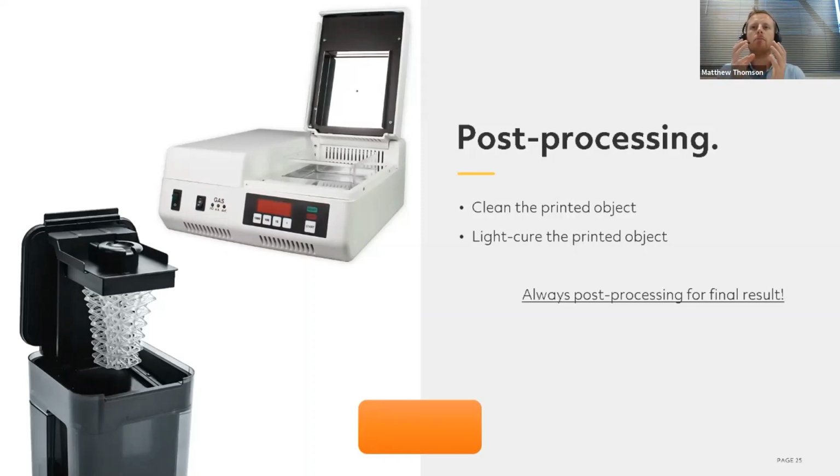Then there's the post-processing. So many of you will have used a wash, like we see in the bottom left of screen here, a Form Wash, where you take your object, drop it in, swirl around some isopropyl alcohol, take it out, dry it, cure it, done. Whereas for the Ceremco, we have to be very specific about it. We have to take a brush and a certain alcohol and brush off any extra resin. And this is, again, part of the TGA workflow.